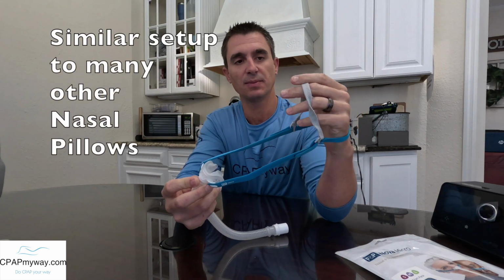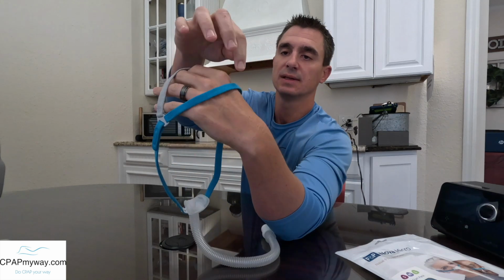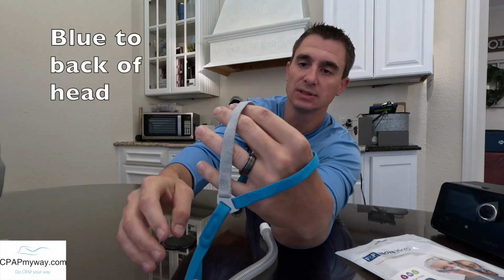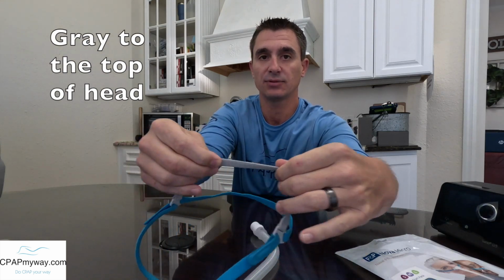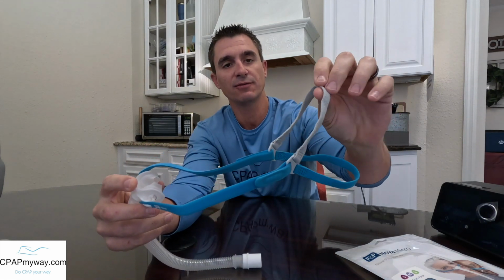As far as the design of the mask, it is the same style as most nasal pillow masks that are out there. Split back of the headgear, right? So you'll see that the blue portion of the strap goes to the back of your head, the gray portion goes up on top of your head. Both of these straps are extremely elastic on the back of the head and at the top of the head. The side straps here are pretty firm, so they're not going to give a whole lot. Where you're going to get your conforming fit is going to be on these straps here at the top and on the back of the head. You'll also notice the adjustments on this headgear come from the top down as opposed to from the bottom up. I'll go over why that may or may not be a good thing for you, and the pros and cons at the end of the video.